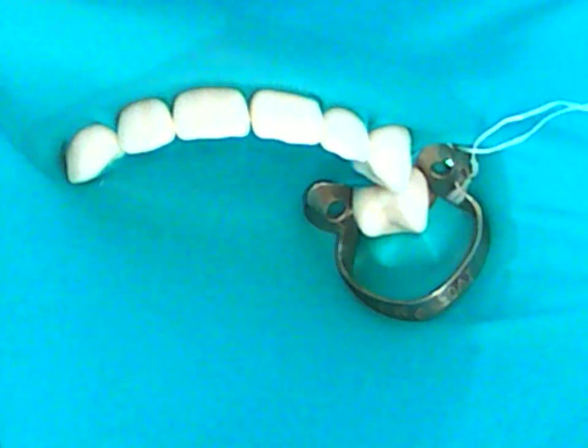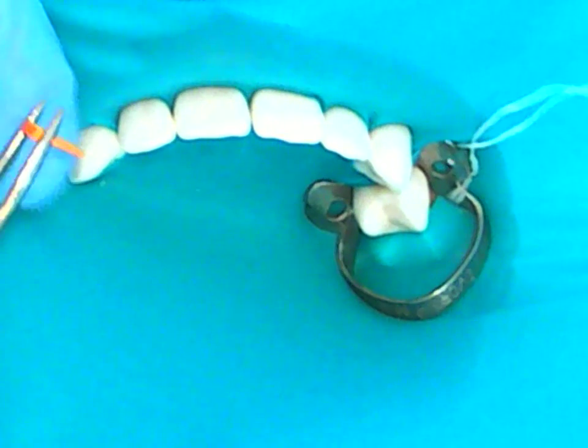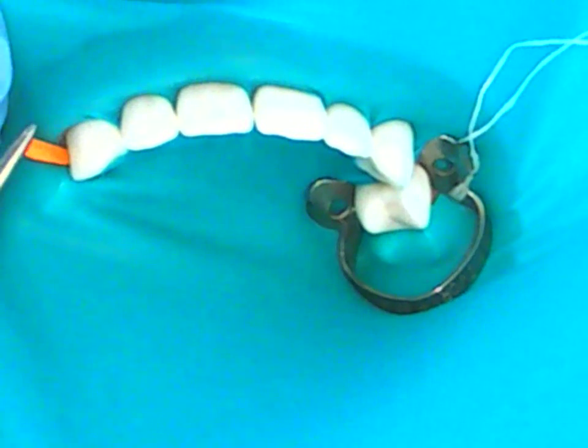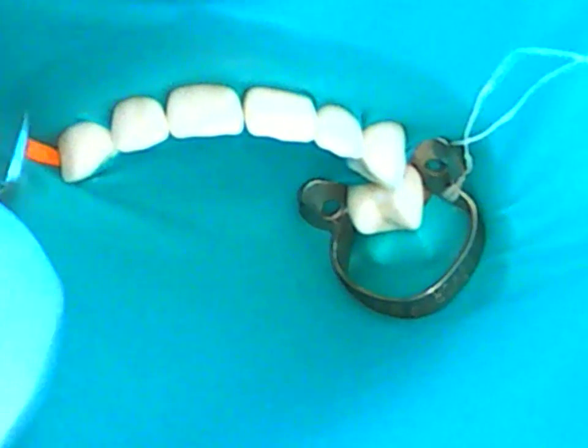Okay, for a ligature in this case, it is very difficult to use a floss ligature on a central or lateral tooth. In this case, we're isolating 2-4 to 1-3. You can do it, it's difficult, so I'm going to show you some other alternatives to dental dam isolation ligatures. The first option is using a wedge. You could simply place it on the distal of the 1-3. That would secure and hold your dental dam in place on the opposite end from where you're working. That's perfectly fine.